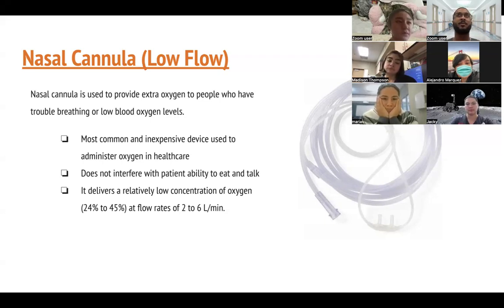And it does only give a low concentration of oxygen, 24 to 45% at flow rates of 2 to 6 liters per minute. So very low compared to the other ones.